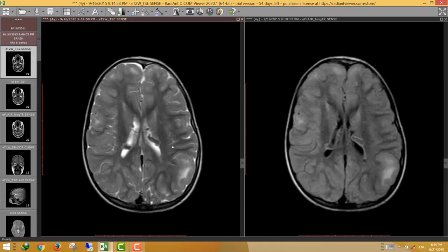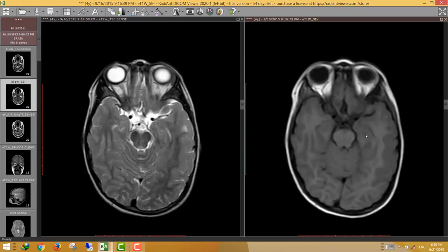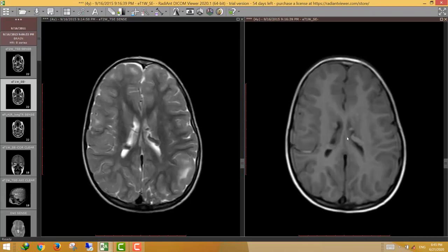To differentiate between the nodules of gray matter heterotopia and tuberous sclerosis, compare the signal of the nodules to the cortical gray matter. In gray matter heterotopia, the nodules are similar in signal to the gray matter, while in tuberous sclerosis the nodules are different in signal. In this case, the nodules on T2 are darker — lower signal — compared to the gray matter. We can appreciate this more on T1-weighted images, where the nodules are higher signal relative to cortical gray matter.